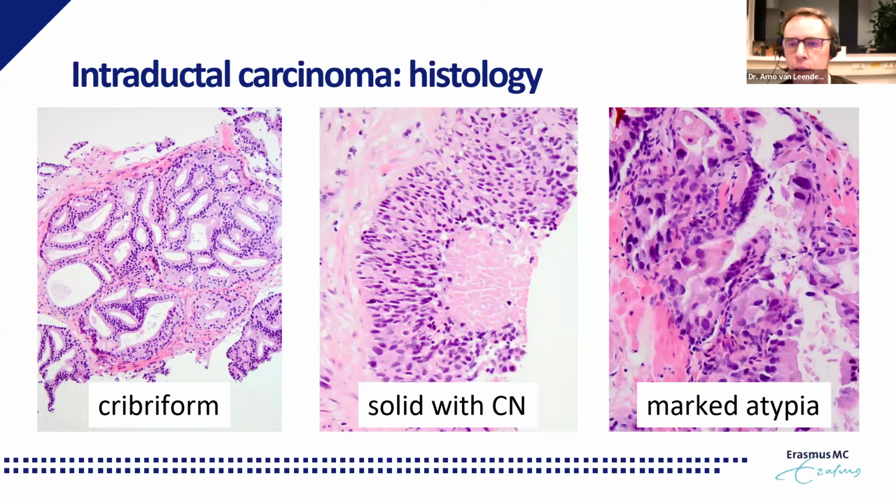And on the right side, there's something which is far more rare, very atypical cells within pre-existent ducts that really by far exceed the normal size and atypia found in prostate cancer. And here again, it's very important to distinguish from urothelial CIS extending into the prostate.